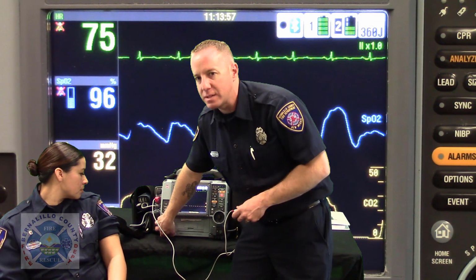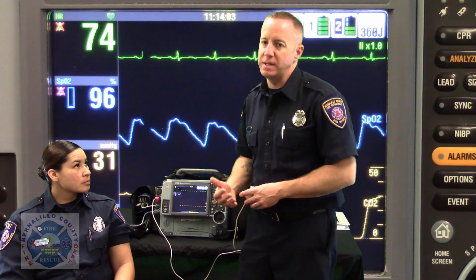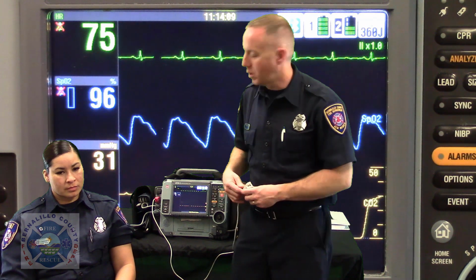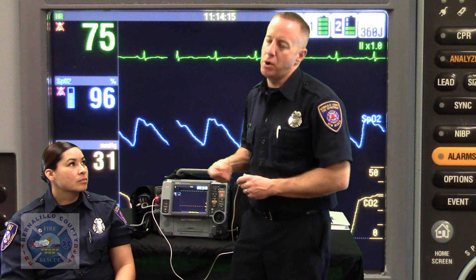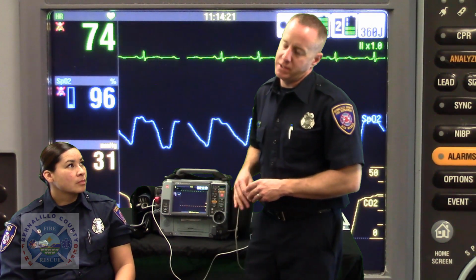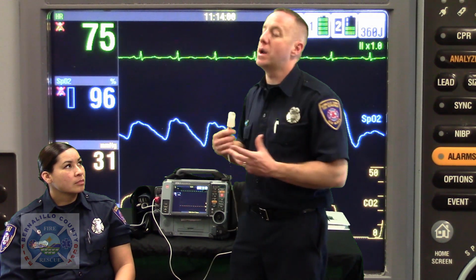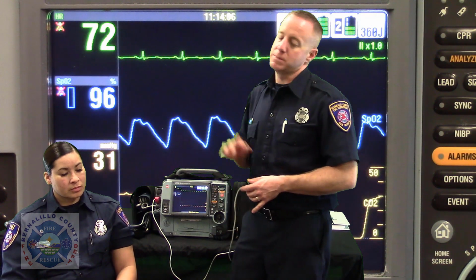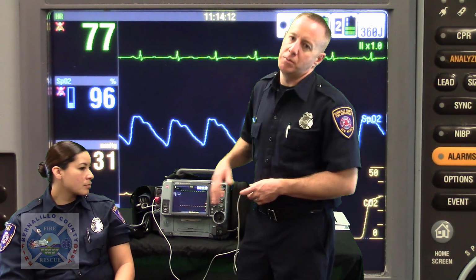There are 2 empty spots on the Lifepack, and those are for additional invasive monitoring modules that are very expensive. They're very hard to maintain. They use those in the intensive care setting and for critical flight transport. For instance, you would have an arterial line which would give you your real-time blood pressure moment by moment. That's an invasive blood pressure, versus the cuff, which is giving you a non-invasive blood pressure. Another module that you could have purchased with this unit would be for continuous esophageal temperature monitoring. Obviously, neither one of those pertain to emergency medical services. Again, they're expensive and they're very hard to maintain, so we didn't invest in those. But that's why there's a distinction here between NIBP.